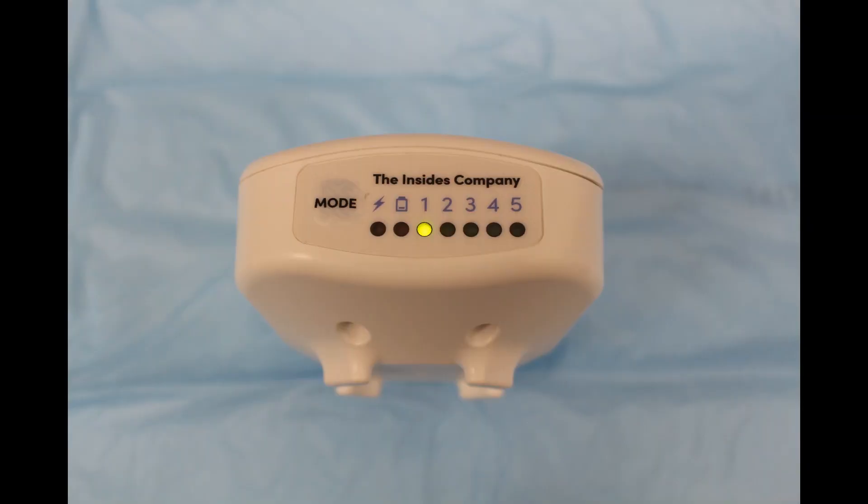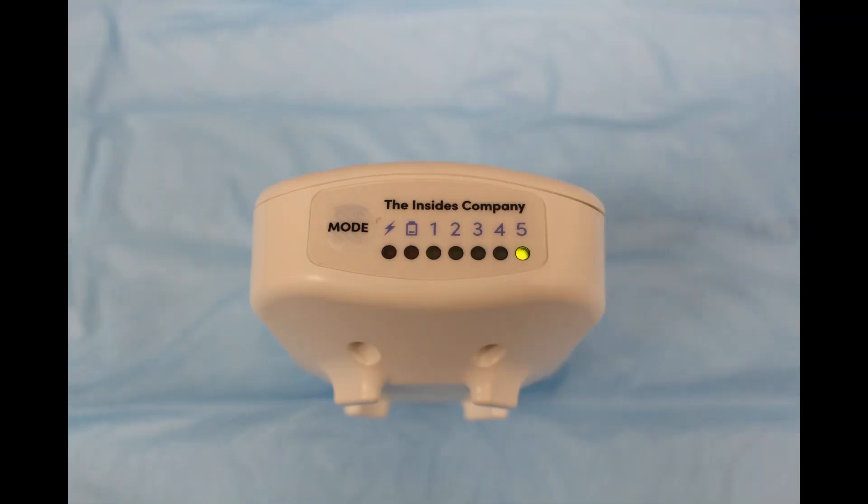The driver has five different speed settings which allows the user to manually adjust the rate of infusion. Mode 1 is the slowest and most useful for thin effluent content. Mode 5 is the fastest and most useful for thick effluent content.